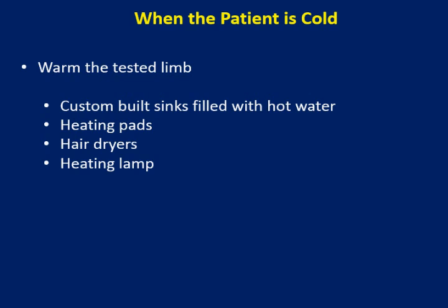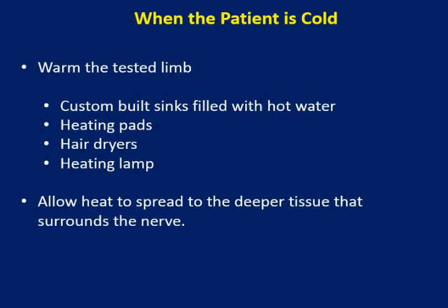have also been used. It is important to allow sufficient time for the heat to spread to the deeper tissue that surrounds the nerve. Note that we measure the skin temperature that will rise as soon as we apply the heating device. We need the core temperature to increase before testing. We should monitor the patient when the heating device is applied to avoid burns and injuries.